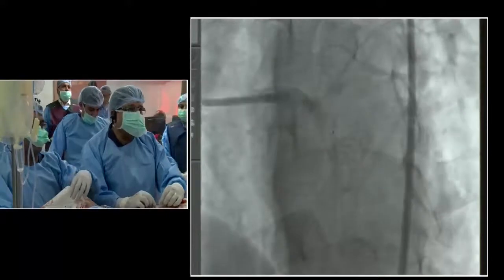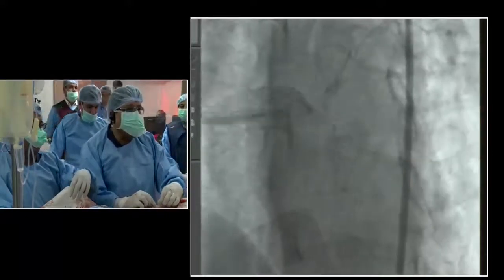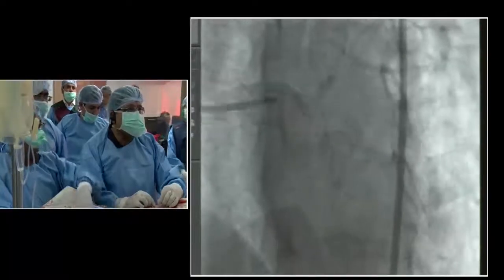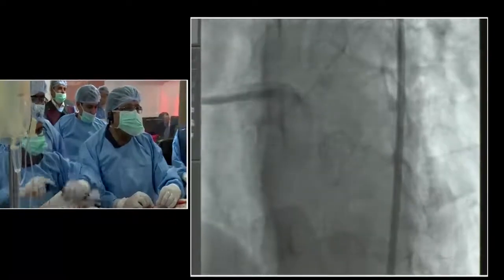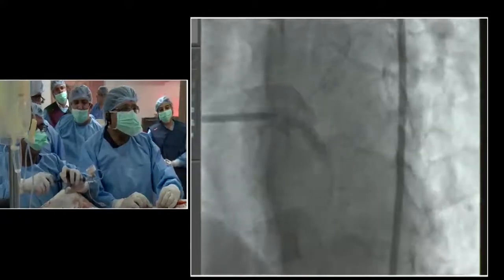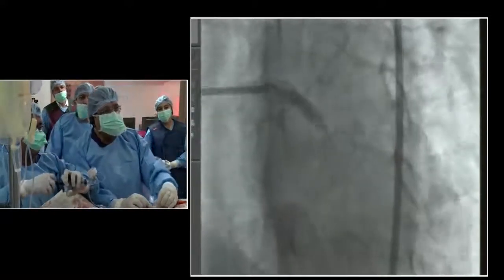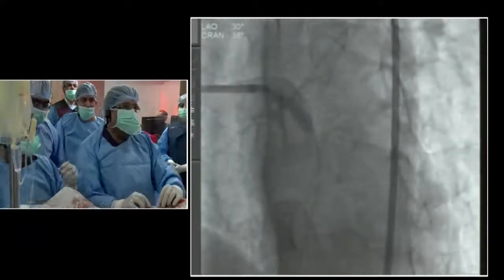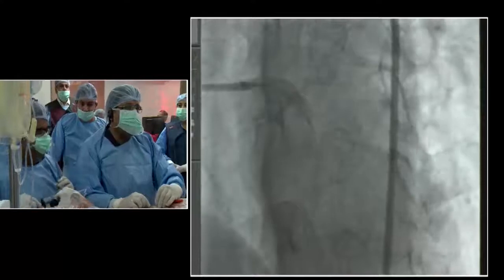Do you have stent boost in your lab? Yes, we have that. We'll just show you. So you go up, stent boost. You will be again able to see where that was recrossed with the wire. Recrossing the side branch. I think it will be from the proximal part. Give me the wire. Yeah. Same one?